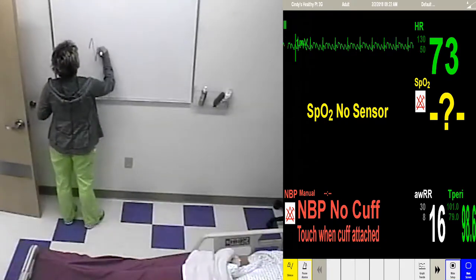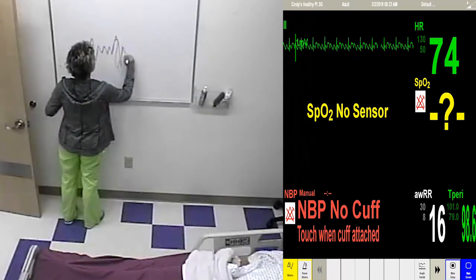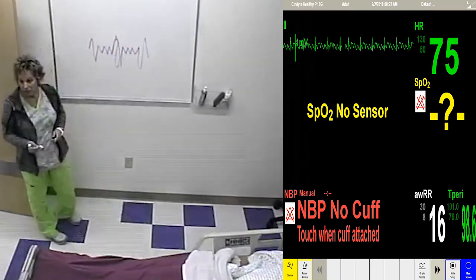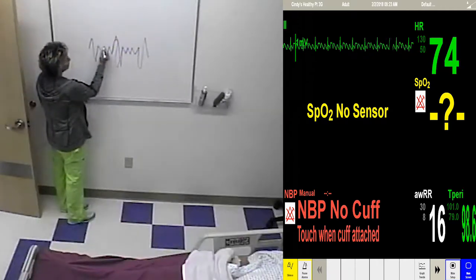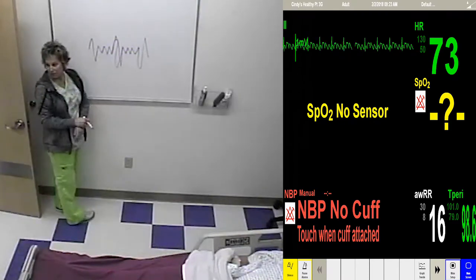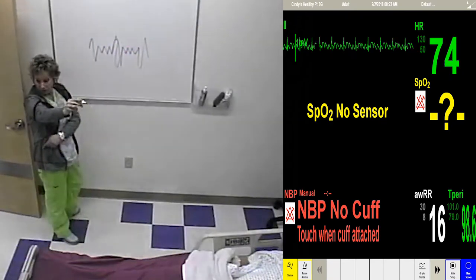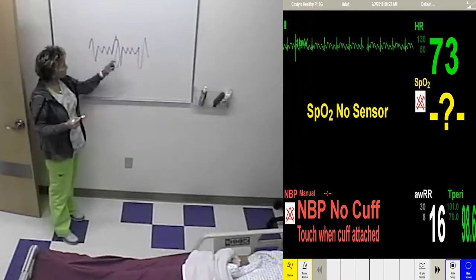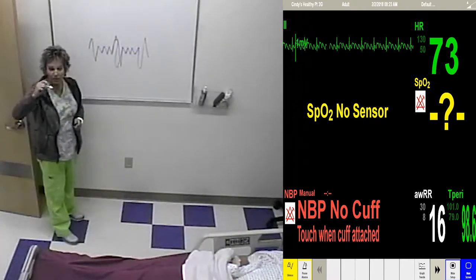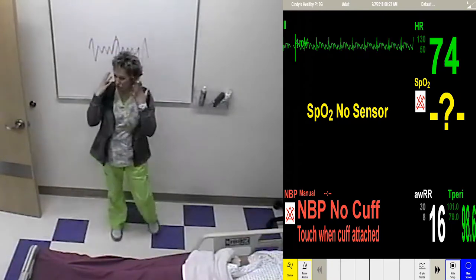So we got QRS and then... Oh, that was awful. Okay, 1, 2, 3. Okay, they're too round, but you get the idea, right? So do you see how these things are like that? There's 1, 2 right there. They can be 2 to 4. They can be a different amount in here. But you see that. Those are a little rounded looking on the monitor. This is just something you should learn, that when you have your QRS and then those uniform humps in between, it's atrial flutter.